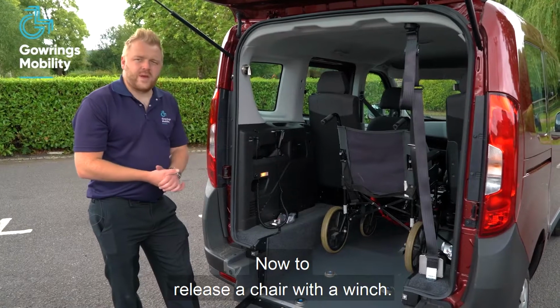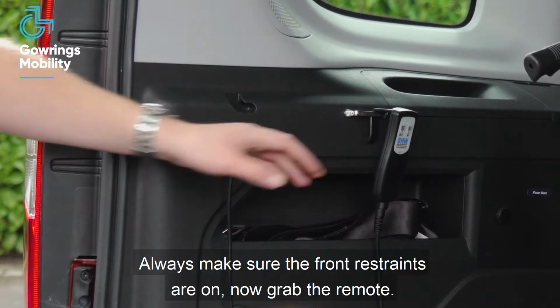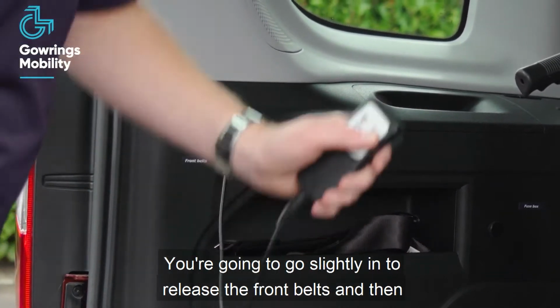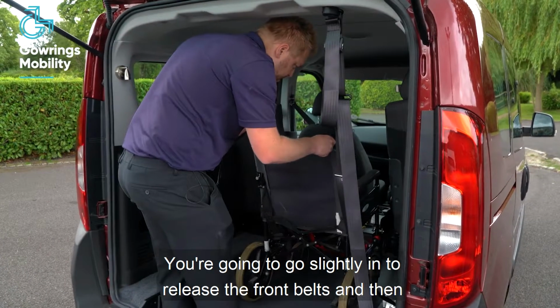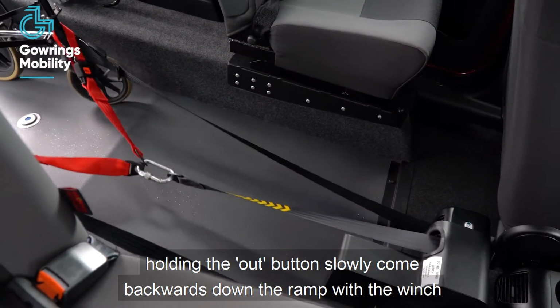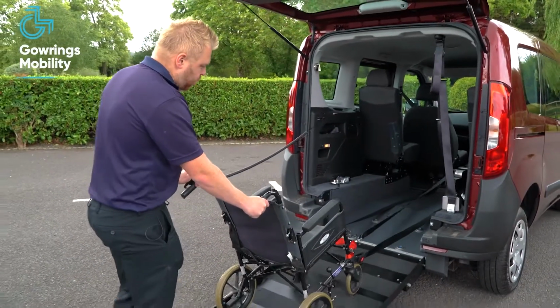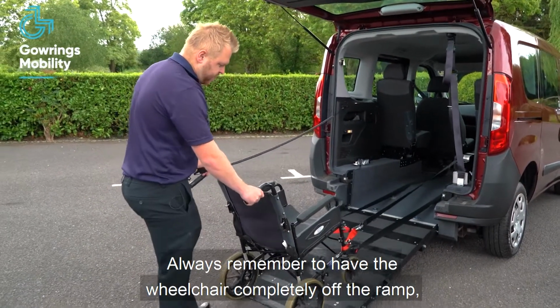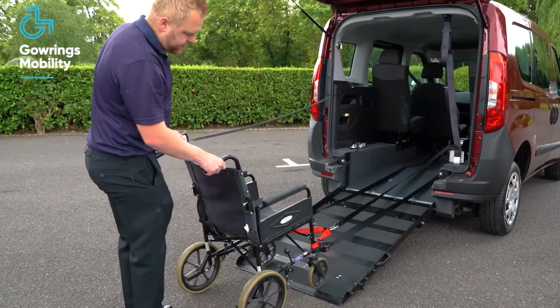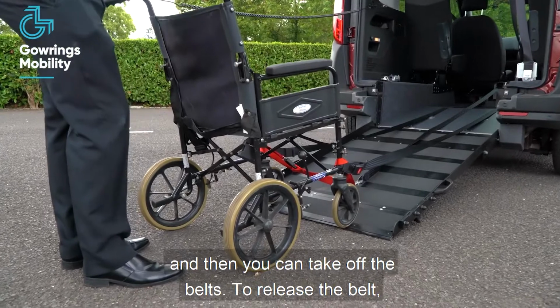And now to release the chair with the winch, always make sure the front restraints are on. Grab the remote, you're going to go slightly in to release the front belts, and then holding the out button, slowly come backwards down the ramp with the winch taking all the weight. Always remember to have the wheelchair completely off the ramp, and then you can take off the belts.